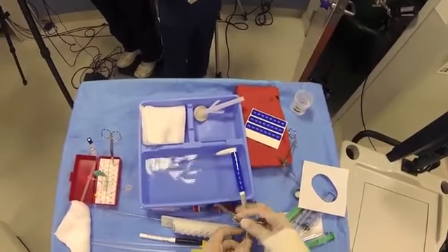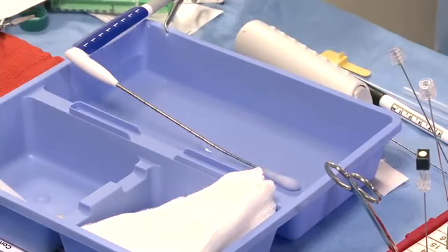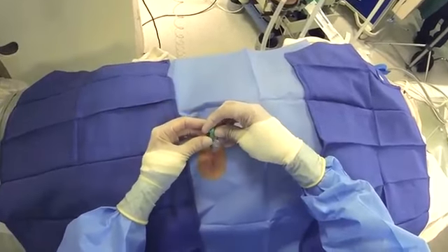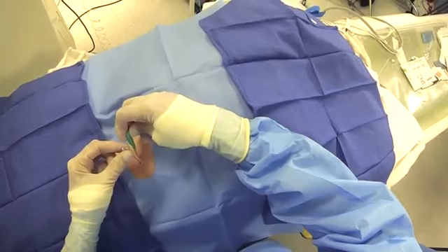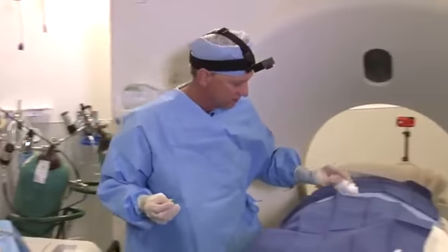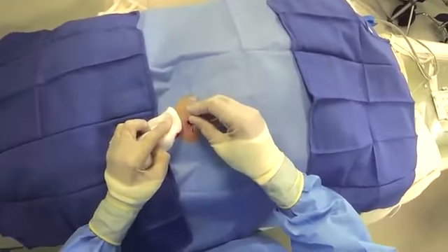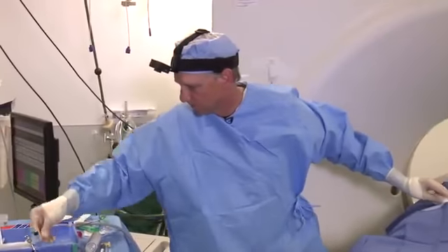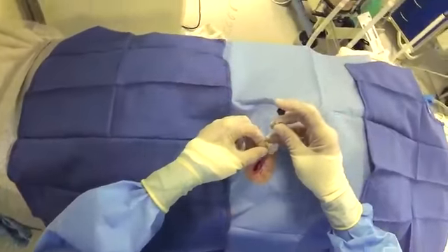So, Michelle, let's get another probe and we'll get that one going. Based upon this marker needle and the need for 2 probes in the center of this, I want one of my probes to be medial and one of my probes to be lateral. We'll put guide needles in. This is just a hypodermic. And I also happen to have a spinal needle here. We'll pass these parallel to the probe.